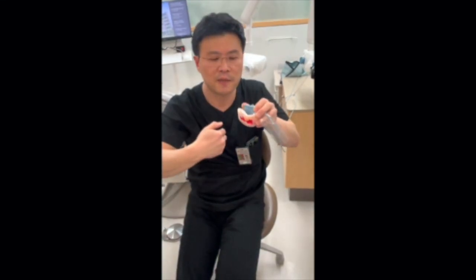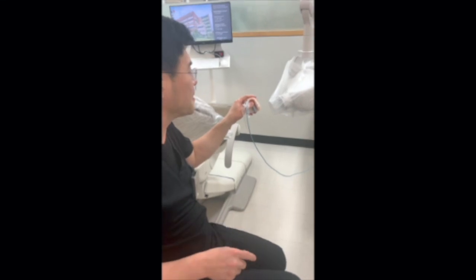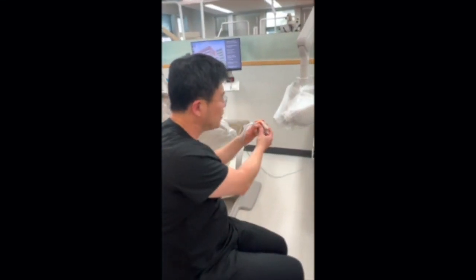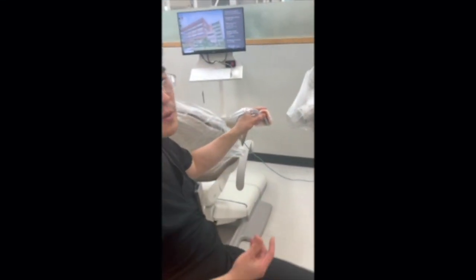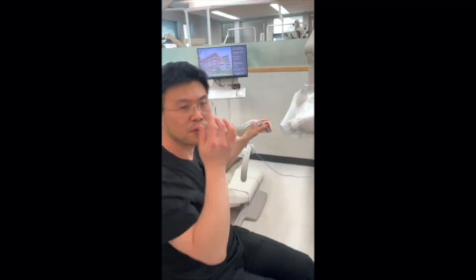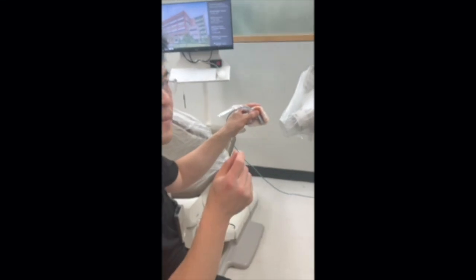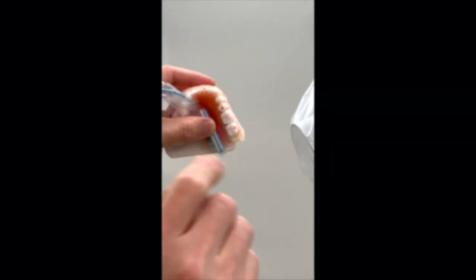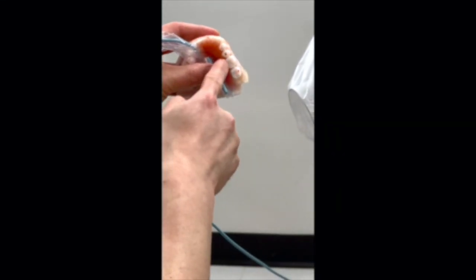So here, we'll talk about the SLOB rule, same lingual, opposite buccal. When you're doing root canal therapy, you've got the access opening, and to measure the working length, you have your hand files in the mesiobuccal. To clarify, we're talking about the first molar here. You have your hand file in the mesiobuccal, mesiolingual, and distal or distobuccal, distolingual.